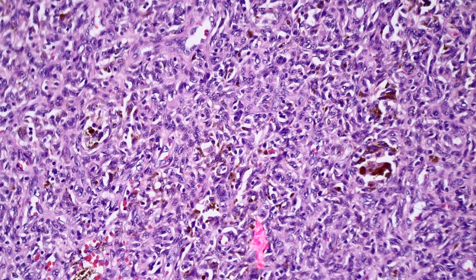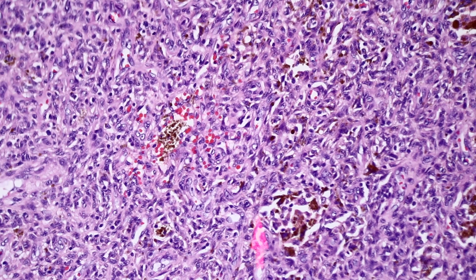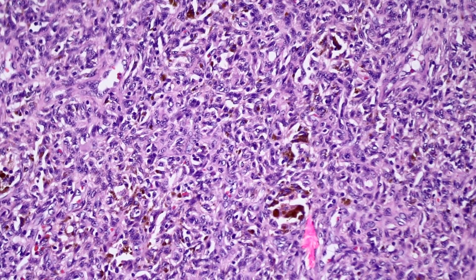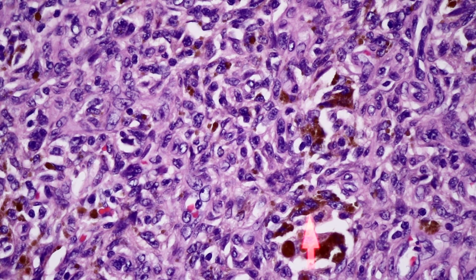You can do whatever you like in your practice, but you can see there's some hemorrhage and there's a lot of hemosiderin. Pockets of hemosiderin-laden macrophages everywhere in this tumor. Again, very useful clues for dermatofibromas. Even smaller dermatofibromas sometimes will have focal areas of hemosiderin and hemorrhage, and those are useful clues to the diagnosis of dermatofibroma. And those are both things that I almost never see in DFSP.